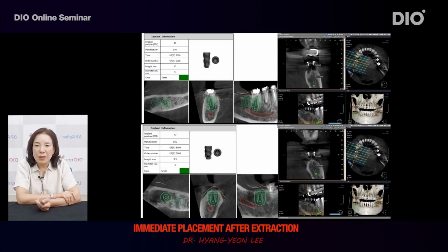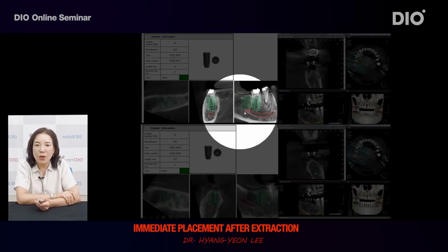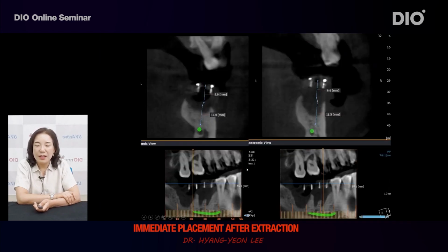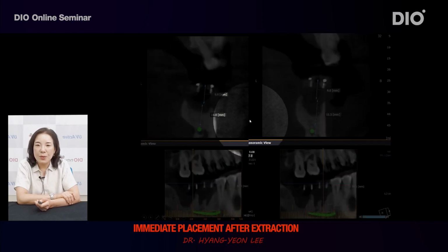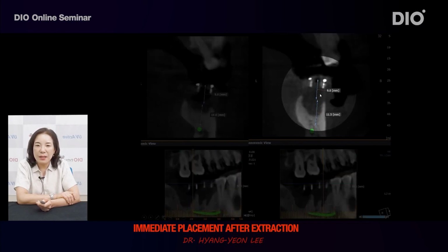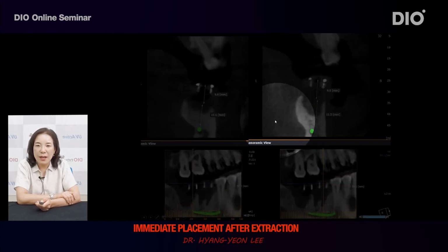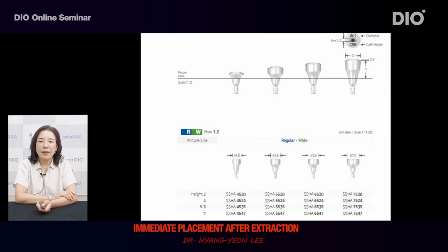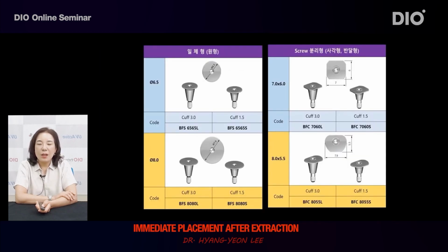First, check to see if the guide fits well as originally planned. For this patient, implant surgery is commenced after having checked the offset and the length of the implant by inserting the guide and confirmed that everything is all right. In addition, it would be a good idea to think about whether to put the healing abutment later or to put a bone-forming screw into the tooth extraction socket.